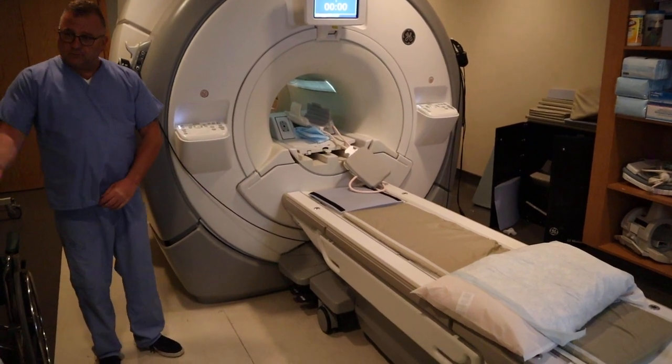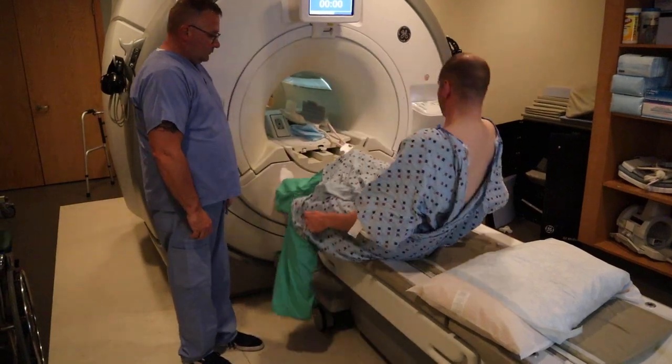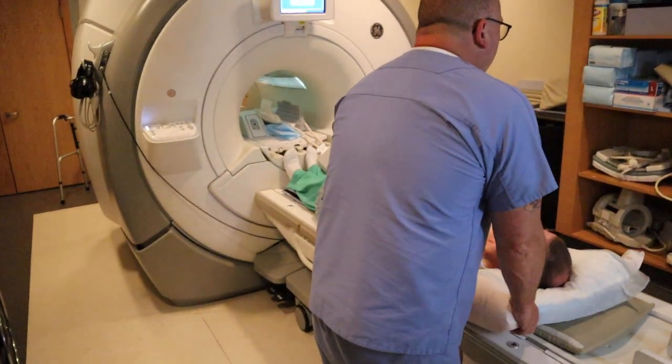We're now going to position for an MRI of the elbow. There's going to be no coil on the bottom of the table — we're actually going to be using a flex coil here.